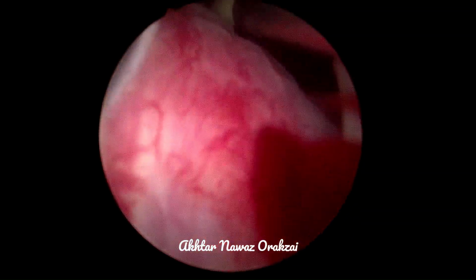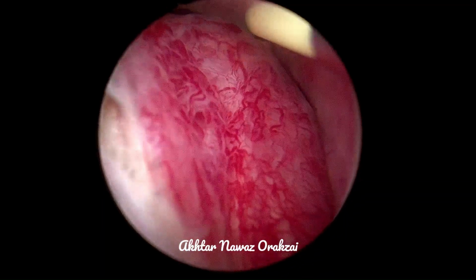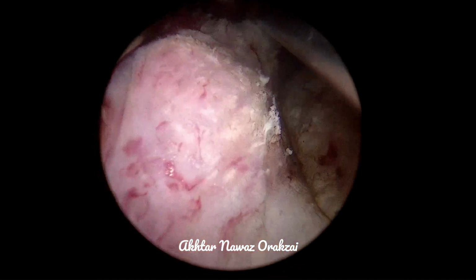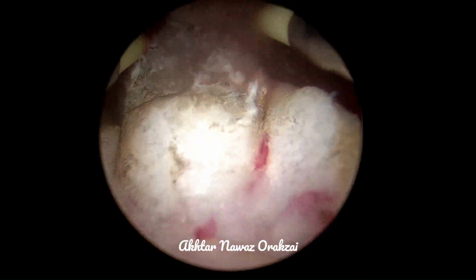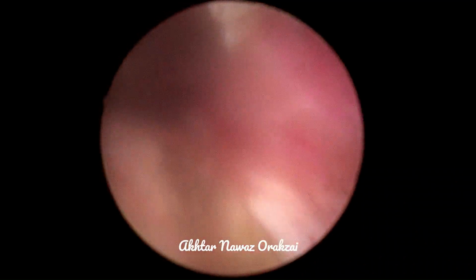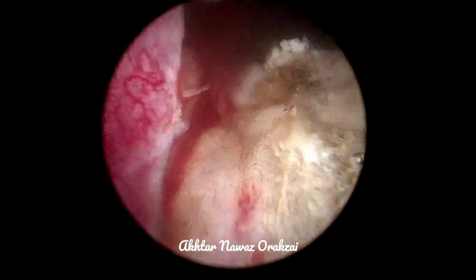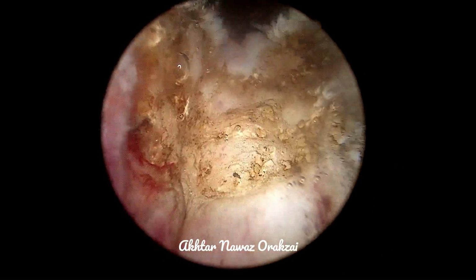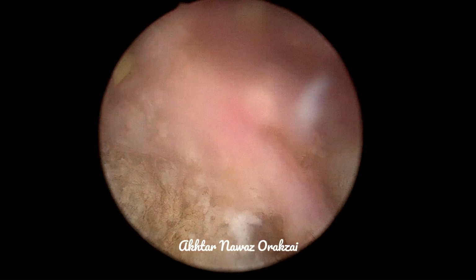As a general rule, in transurethral resection of the prostate, we must create a crater by resecting the median lobe first, so that circulation of fluid in the resectoscope becomes efficient, and when the circulation is efficient, the vision will be better.